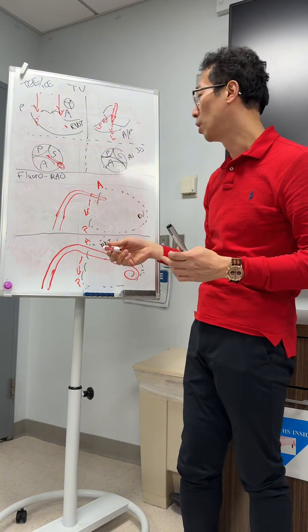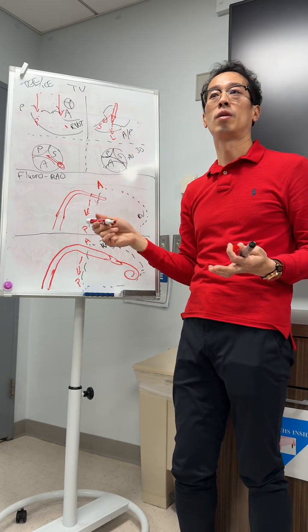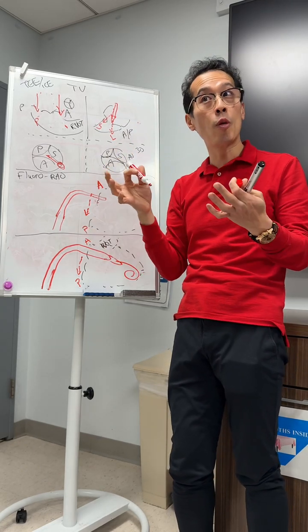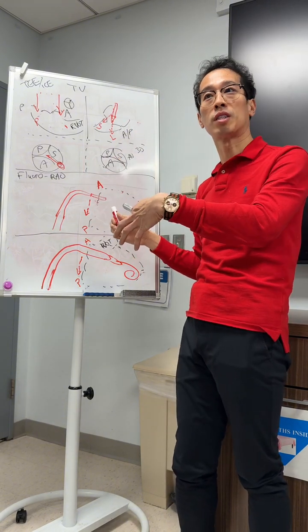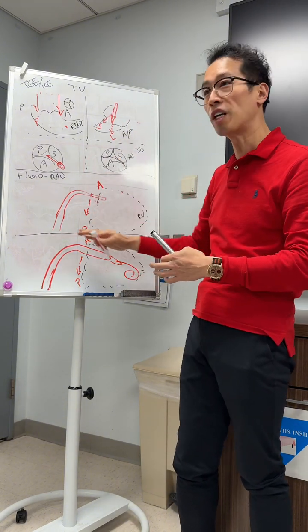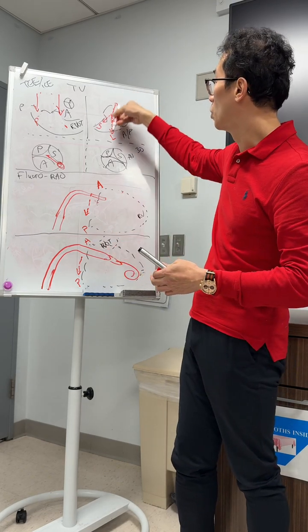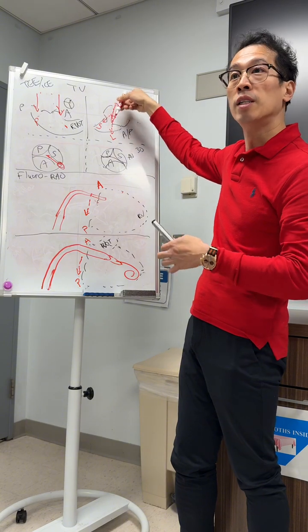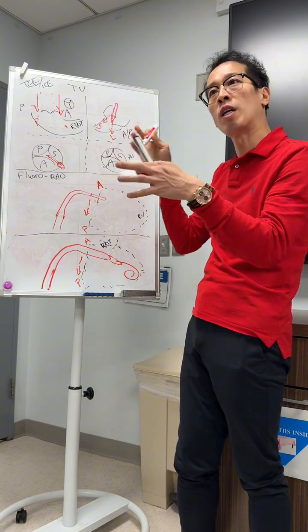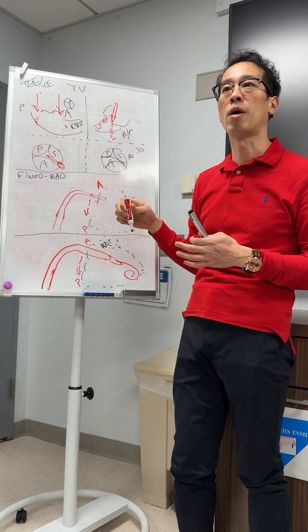You say standing up. Now, TTVR is actually similar. Yes, there's a secondary flex to help you, but first thing we like to do actually is to clock the whole system. Not so much, because remember, there's a stiff capsule. But you can see that when your TTVR system is like this, you clock a little bit, actually would help a little bit already. Then you fine adjust, because you don't want a lot of flexion in the system. It's going to store a lot of tension because you have a stiff wire.